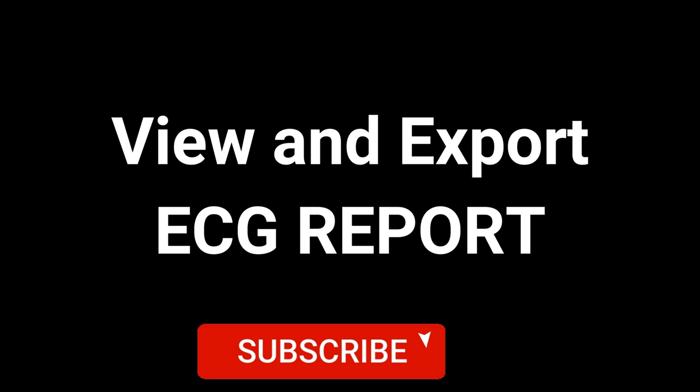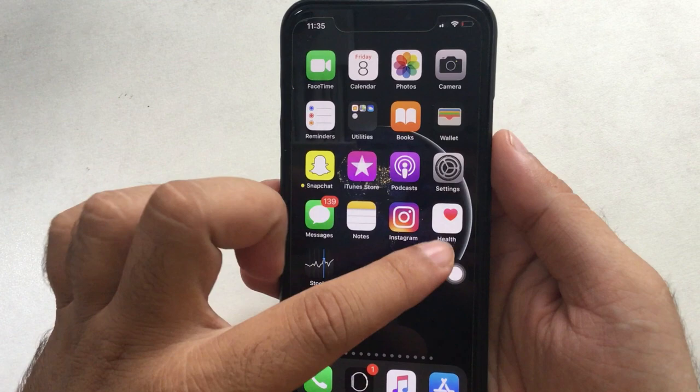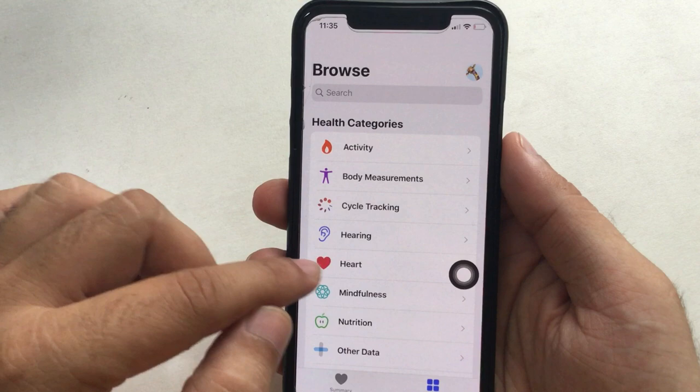Also, we can print a PDF ECG file to check with the doctor. Open the health app on iPhone, tap on the bottom browse tab, next tap on the heart option and find electrocardiogram ECG.